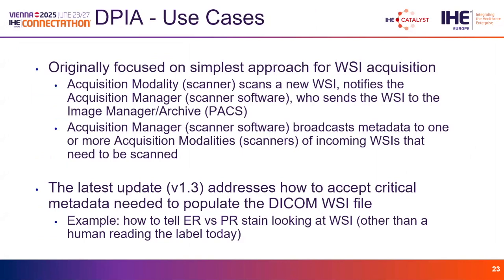So the original design for DPIA was to take a very simple approach for whole slide image acquisition, identifying the minimum data elements that would be useful and functional for vendors to leverage.